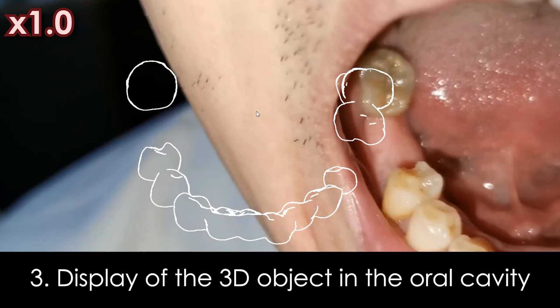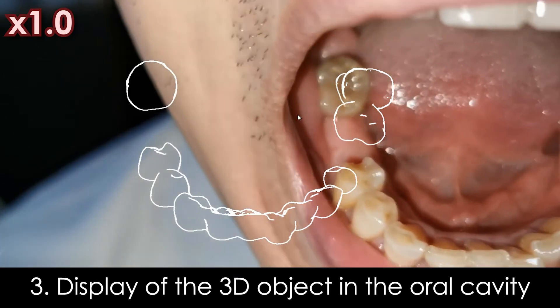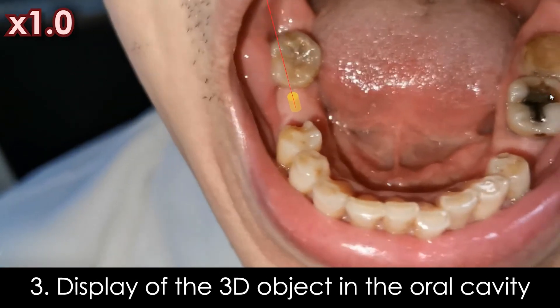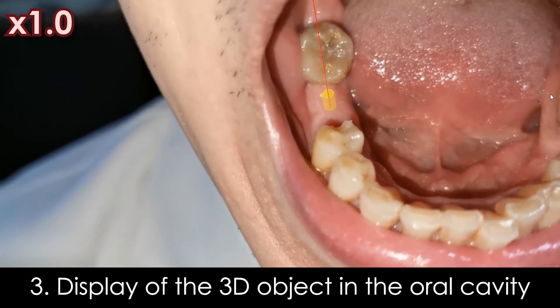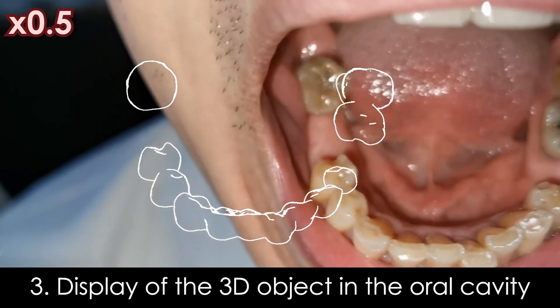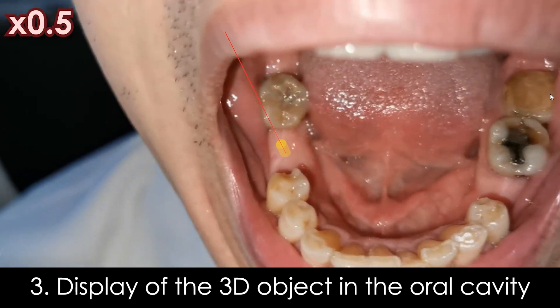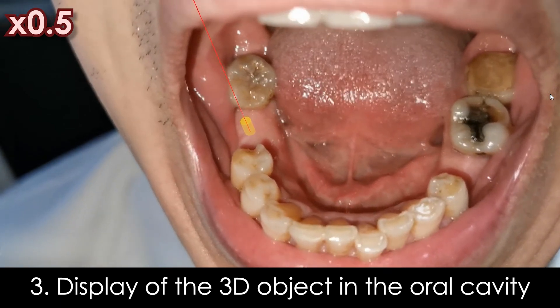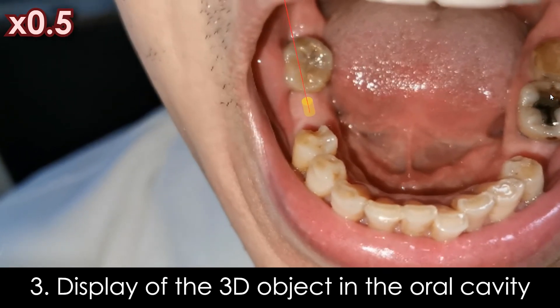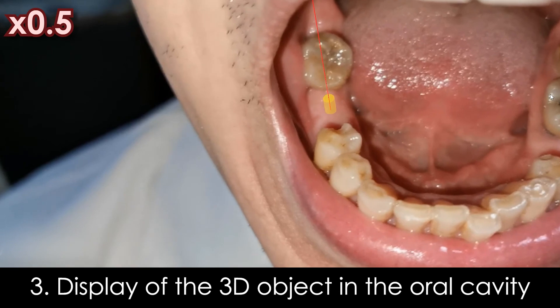Display of the 3D objects in the oral cavity. The 3D objects were displayed in the patient's mouth, proving that our system works in the actual oral cavity same as on the stone model. As you can see, there are no obstructions in the oral cavity.